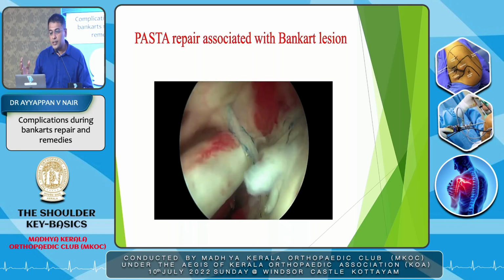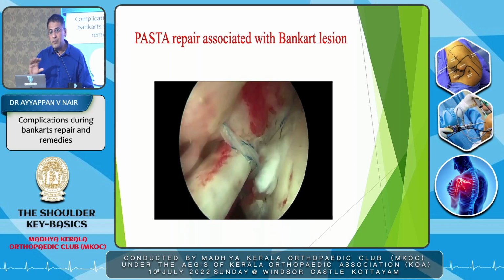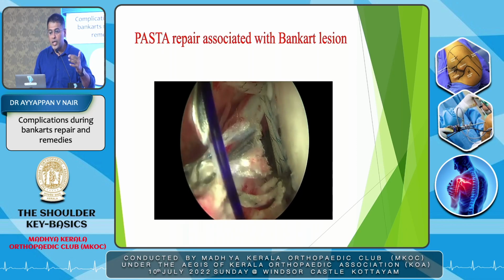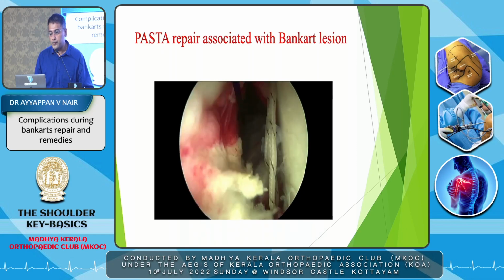So there are cases. So when you do a diagnostic, don't get worried. So finish your Bankart, then you do your PASTA repair. It could be a takedown repair. That means to completely take down, or you can do a parachute or like a transtendinous technique, which I'm doing right now.